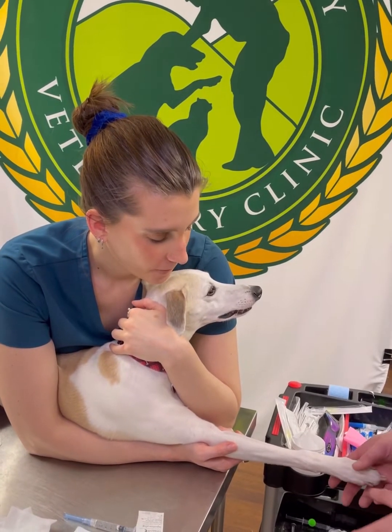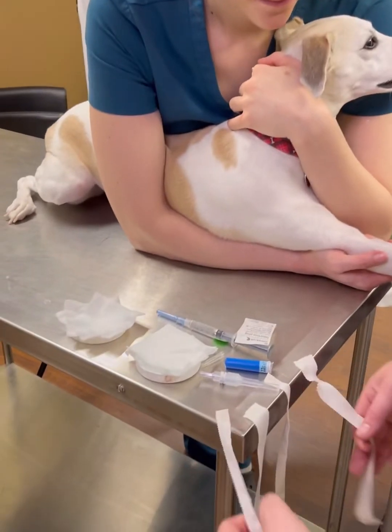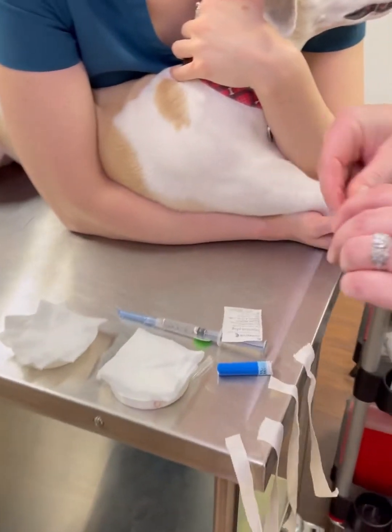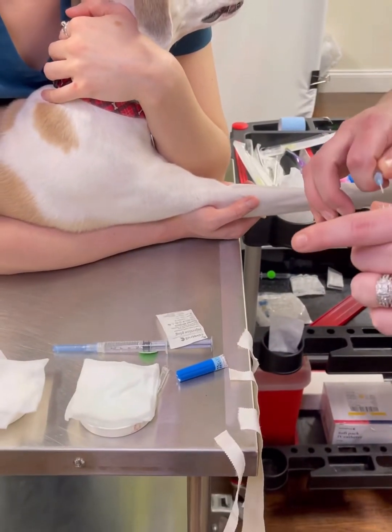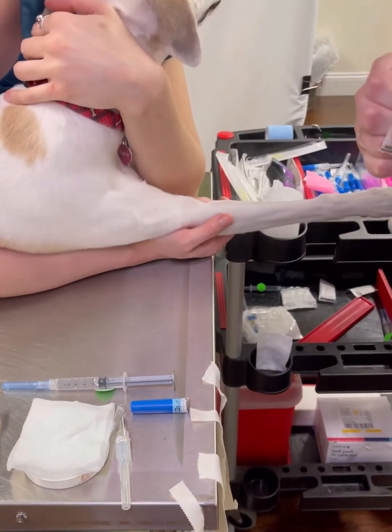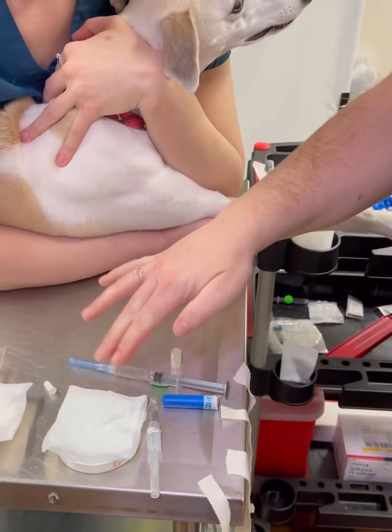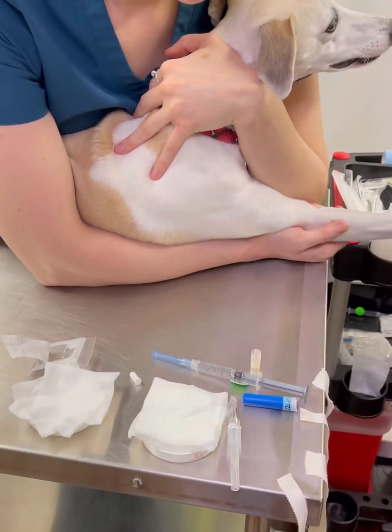This is how you place a catheter. Once you have your dog and it's pre-medded, you're going to gather all the supplies you need. You have your tape, you have your catheter open and loosened, you're going to open your cap, you have a flush, scrub, and alcohol, and clippers.